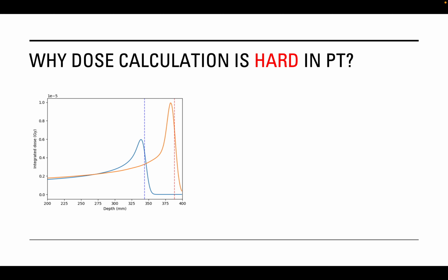A little bit of change in the medium, that is, if it encounters different material in the medium, the position of the Bragg peak shifts. The Bragg peak is the position where almost all of the energy of the proton gets deposited. So the strength of proton therapy, which is to deposit almost all of the energy, that is all the dose, at a particular location, is also its biggest weakness.